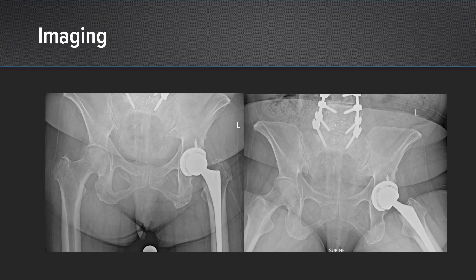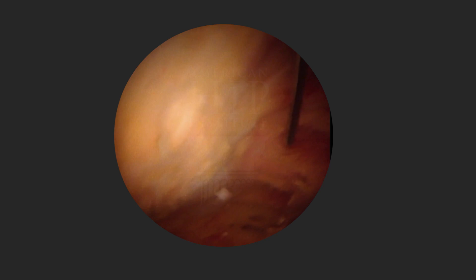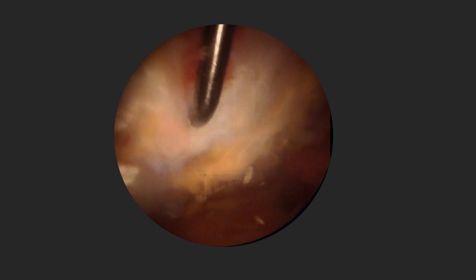On imaging, she had a well-fixed hip replacement on the left side — note the spinal fusion as well. On MRI, we noted plentiful bursitis on the left side and there was a suspected gluteus medius tear. So we proceeded with an endoscopic procedure, and on endoscopy we probed the tendon and found it is delaminated on its deep side.